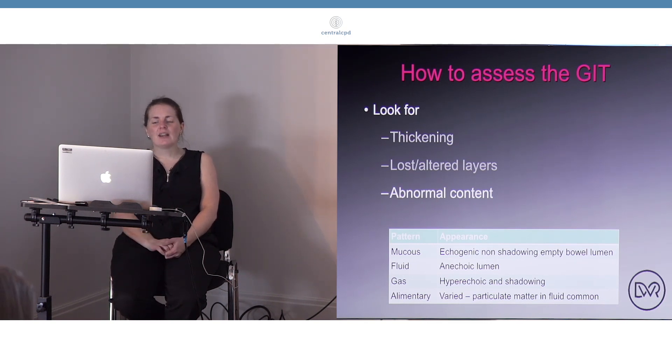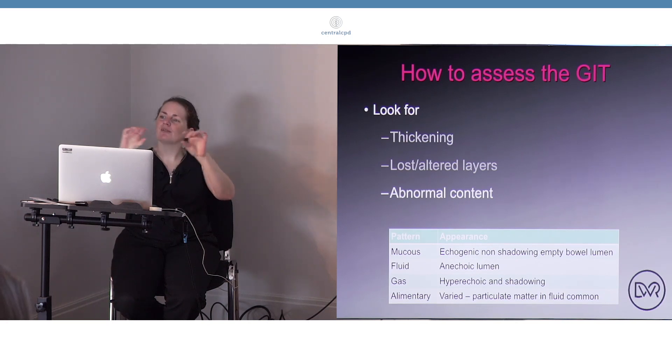Then it's a lot easier to see when it's live. We call a completely empty bowel a mucus pattern. You see, as we saw in the previous example, just that sort of slightly fuzzy hyperechoic lumen through the center. Obviously, if there's fluid present, you'd expect to see an anechoic patch within the lumen of the bowel.